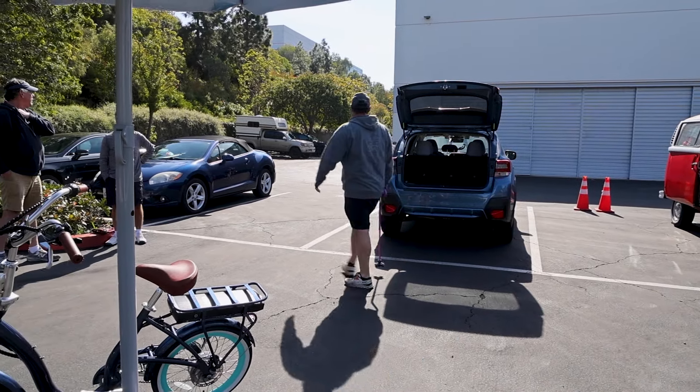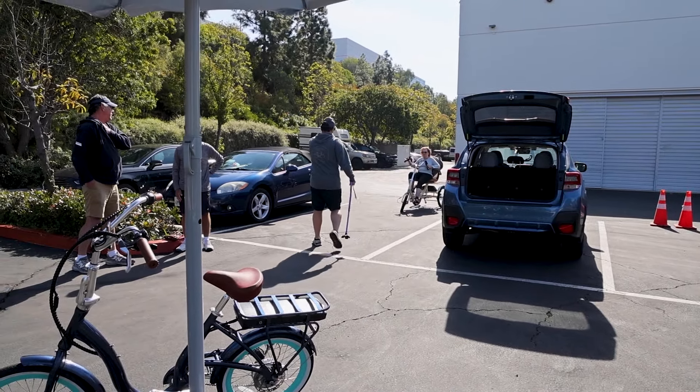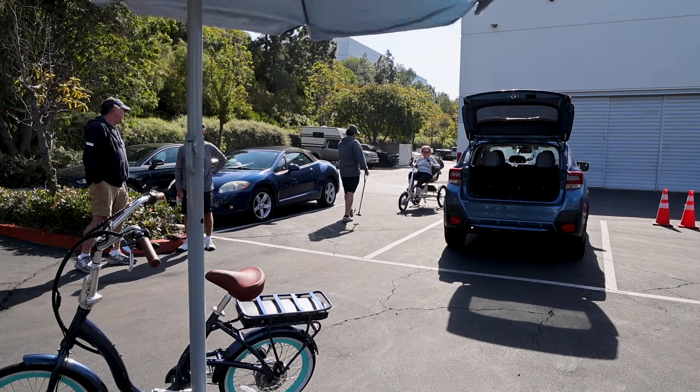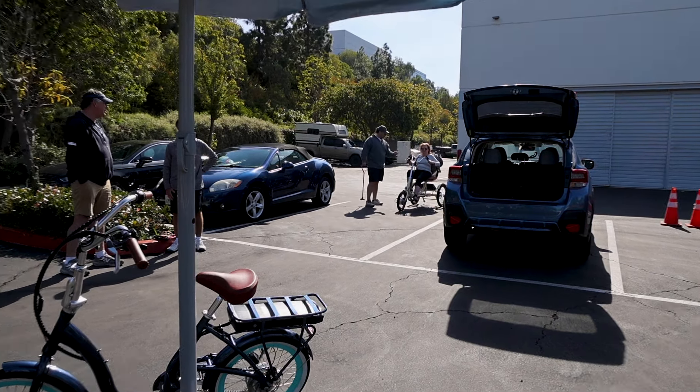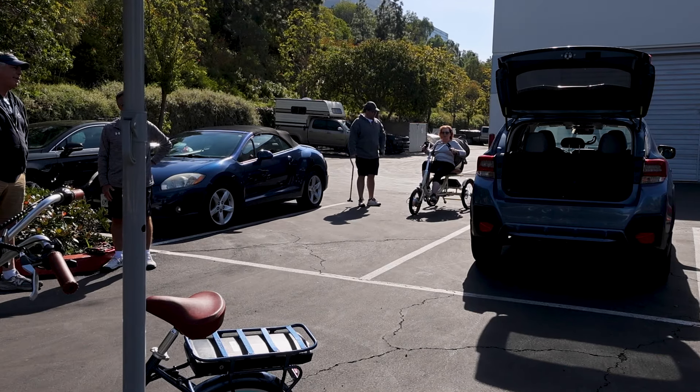While you're riding, keep that left hand up by the brakes. When you're using the throttle, worst case you can pull the brake — it will stop the throttle so you can feel safer.